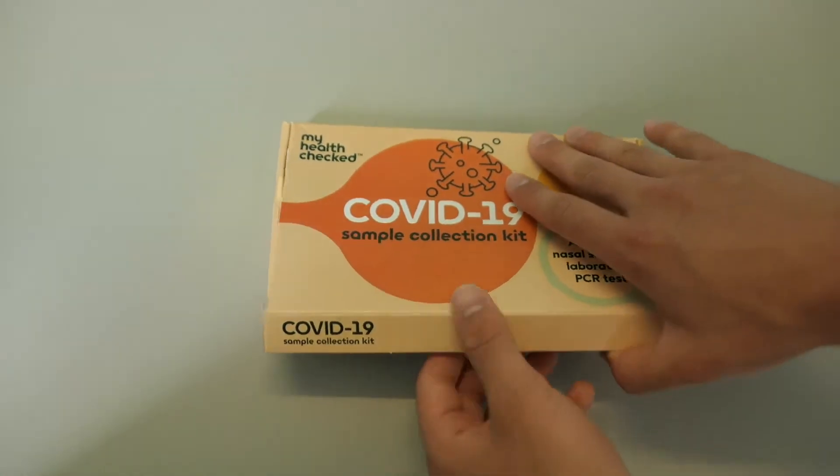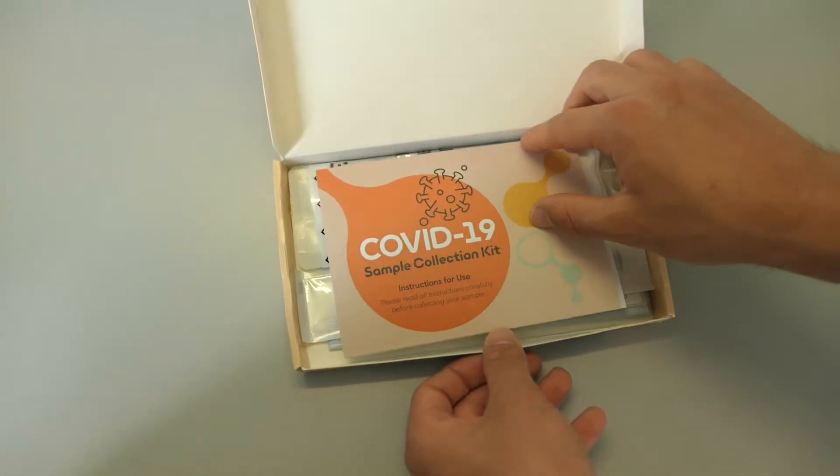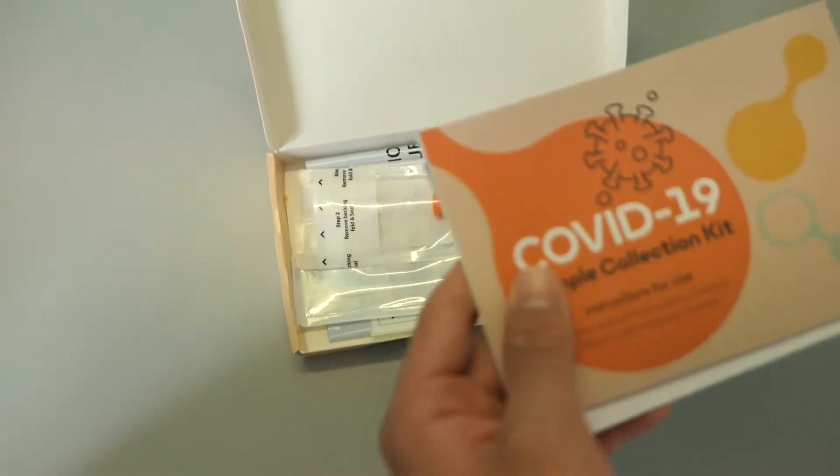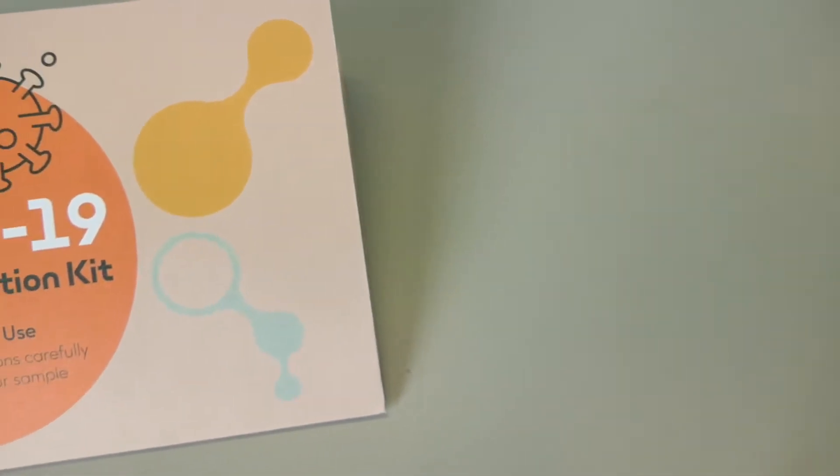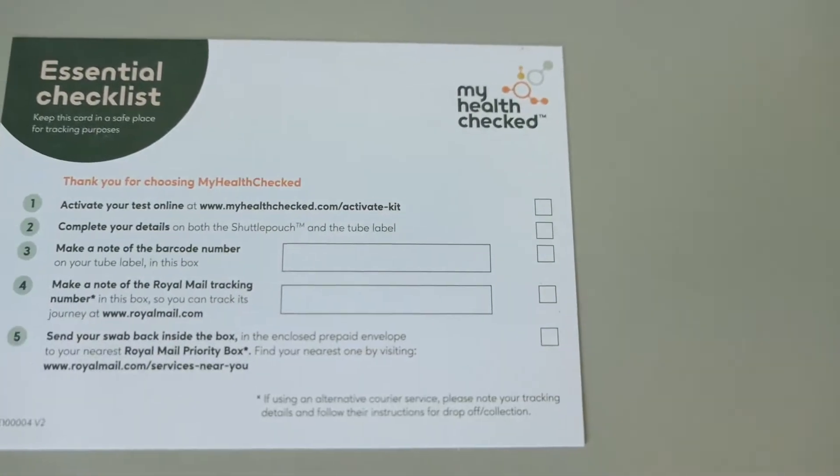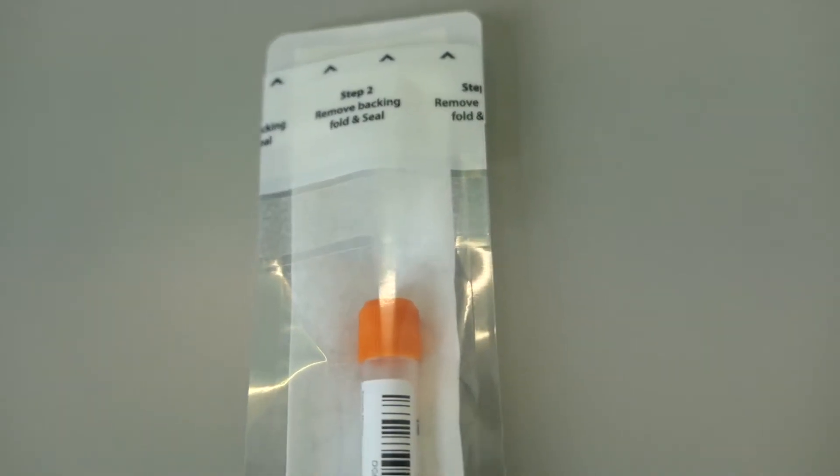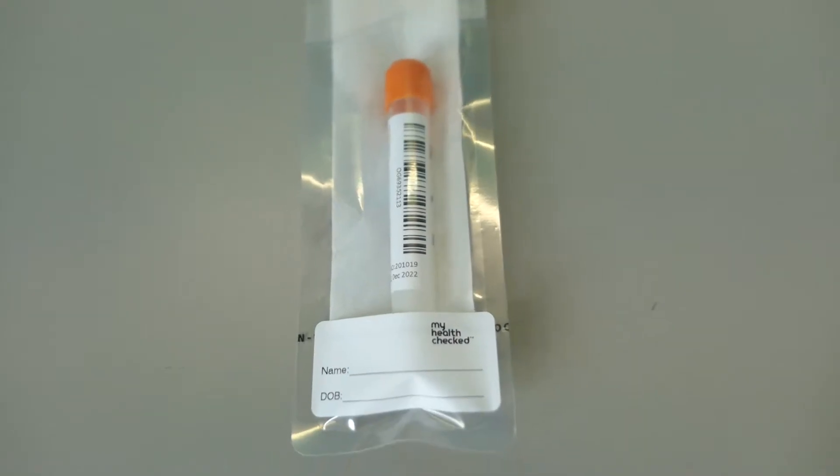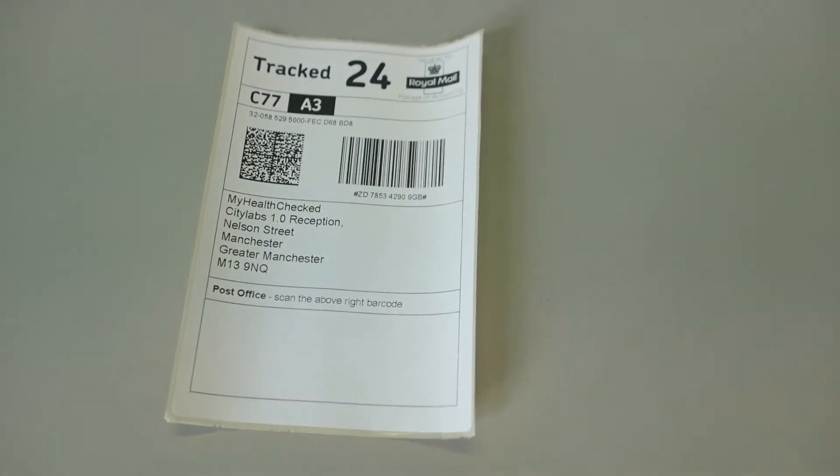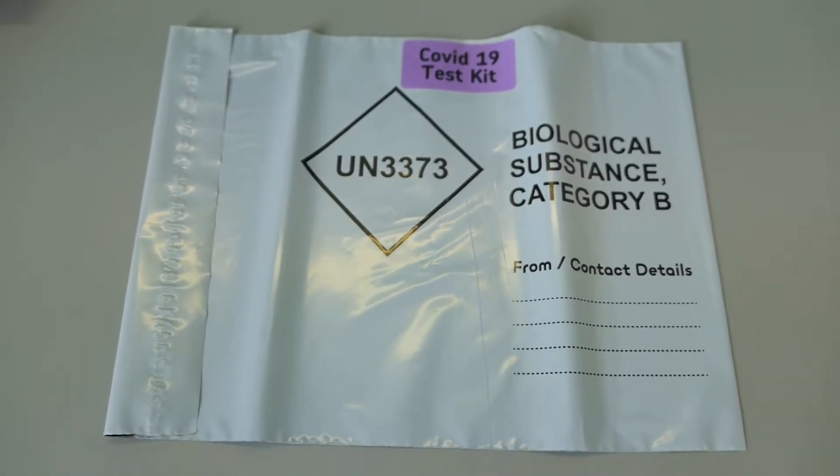After activating your test, you should open your test kit and check if your sample collection kit contains the following: a nasal swab, the instructions for use, an essential checklist card, a tube inside a biohazard bag, and a prepaid tracked 24 Royal Mail return envelope.